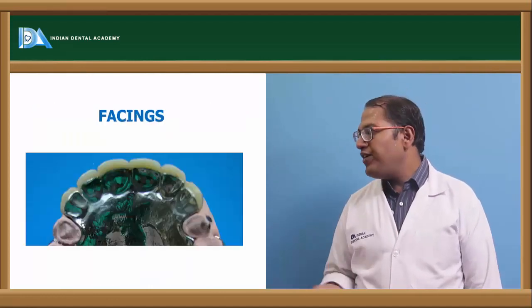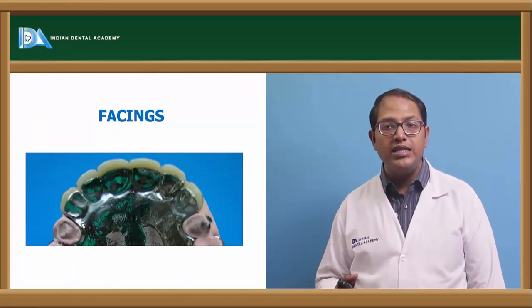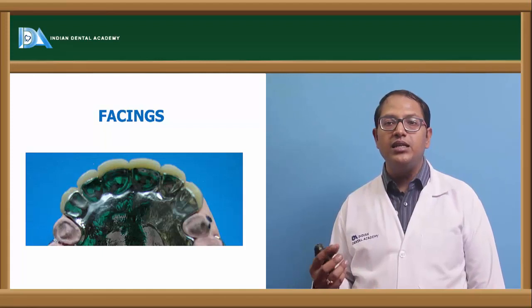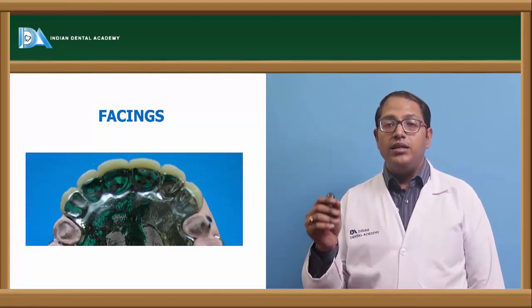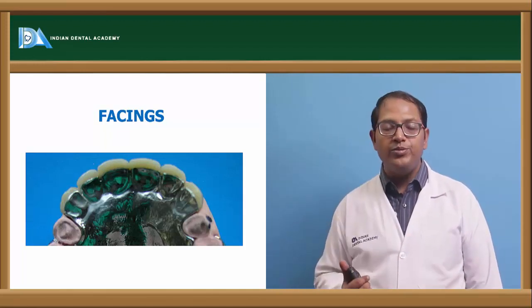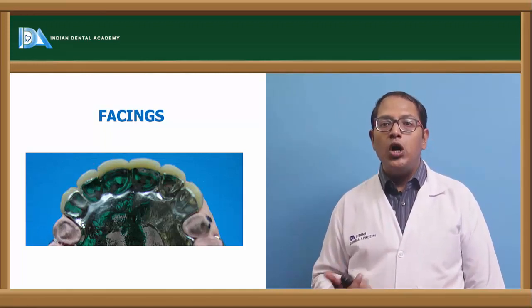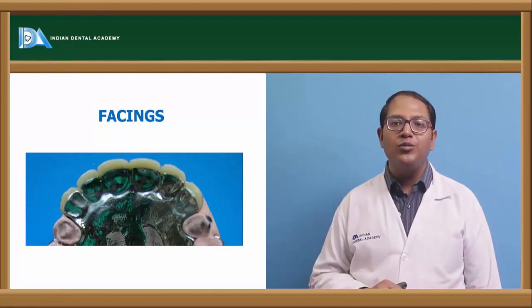If I am only talking about the facings, the advantage is that they give a very nice single tooth replacement where interocclusal distance is present, and also where interocclusal distance is very less. Also, we can use facings where strength is required.